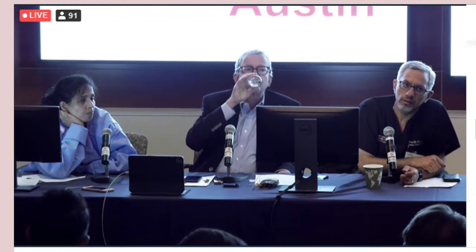When you snare it, is the idea that you snare it and you just pull it? No, you have to snare it, then unscrew, but they don't want you to unscrew if you snare at any position. You can snare any position, but you need to tie the snare when you are in the neck of the device. Hey, Miguel, do you have that impression or not? It's hard. It's very hard to go over the device, but then the actual grabbing point is very specific. You're going to come back and grab it. But once you have it, it's very solid. You grab it.